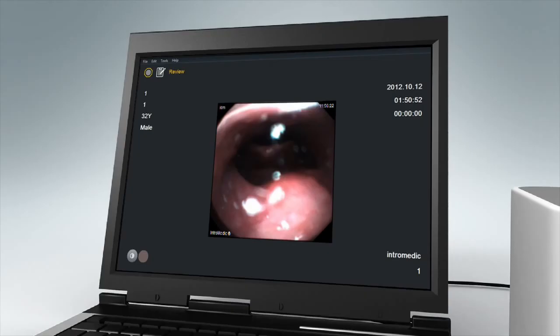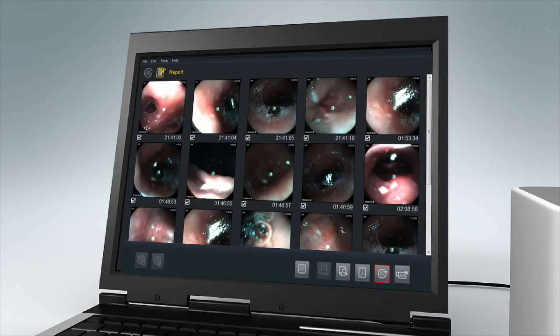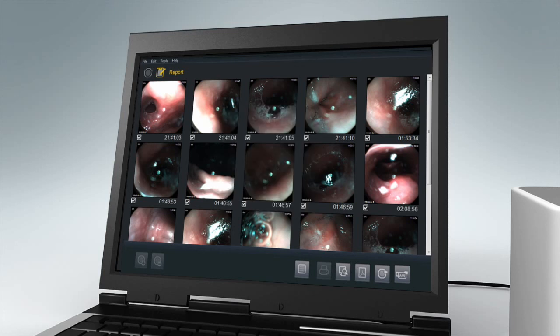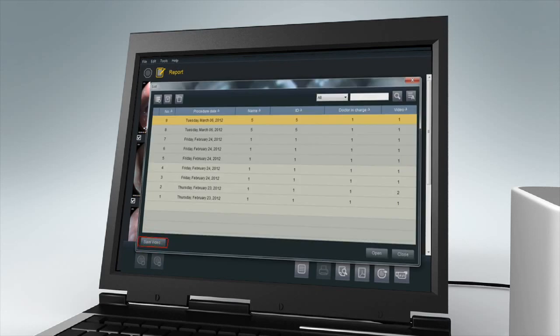To save captured images as image files, go to report mode and press the export button. To save video as an AVI file, go to the menu, select the file from the list, and click the save as video button.